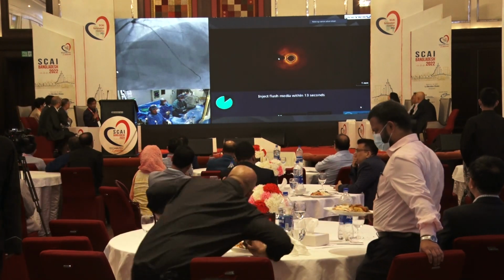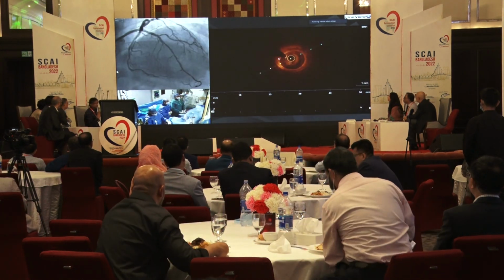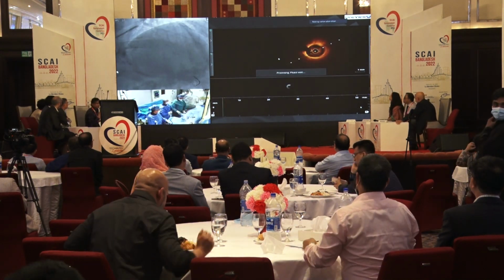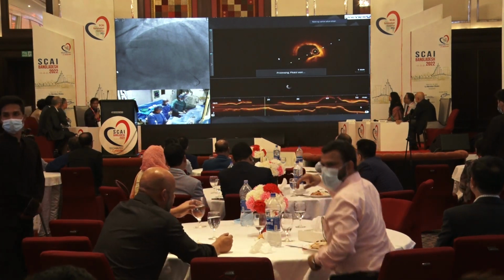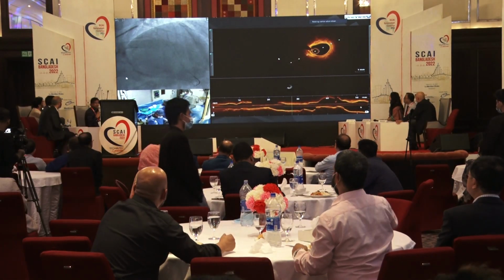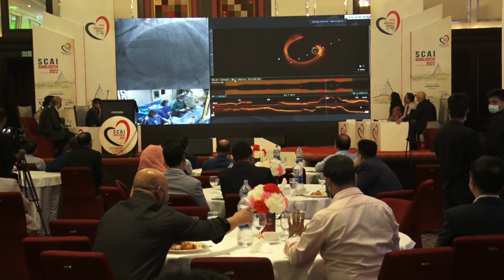I have a quick question. Now that we have done the iFR and then the OCT picture, some labs don't have OCT. If we are using the iFR and then intervention, what post-iFR would you accept to feel that you're good? I think it has to be above 90. Has to be above 90.